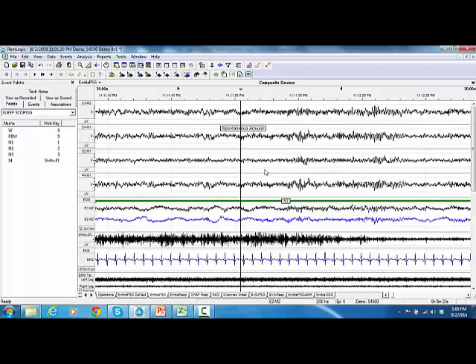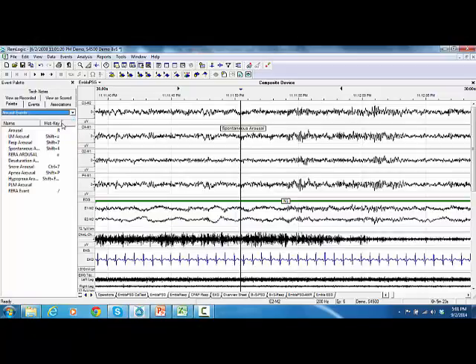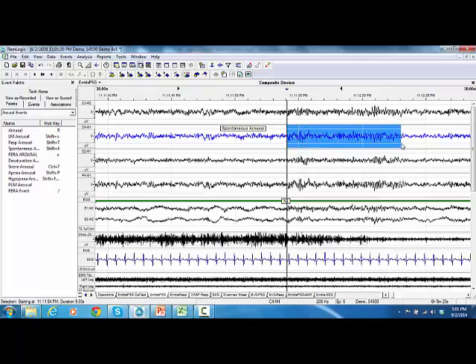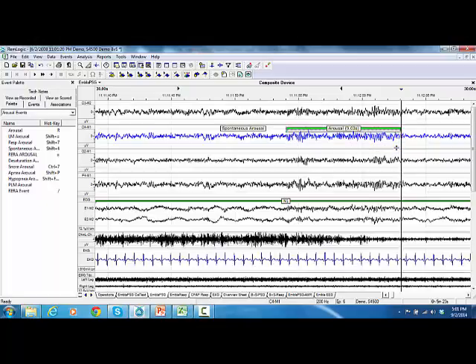To score arousals, select the arousal events from the event palette, then highlight an event by using the mouse with drag and drop, then press the hotkey. You can also score arousals by selecting an event type from the arousal palette.